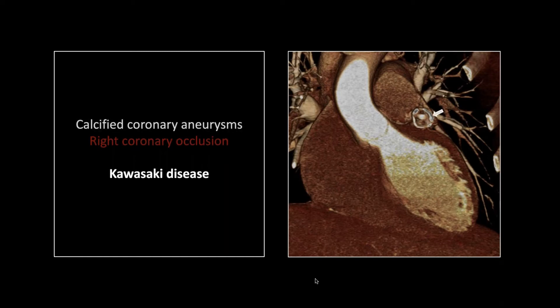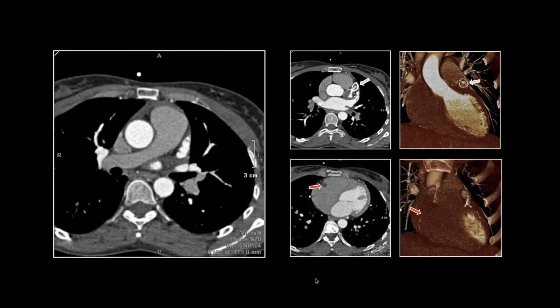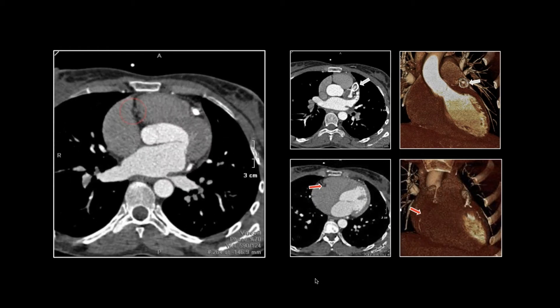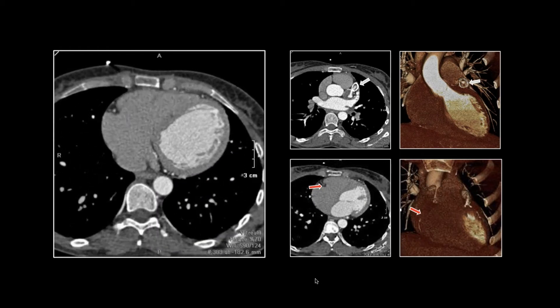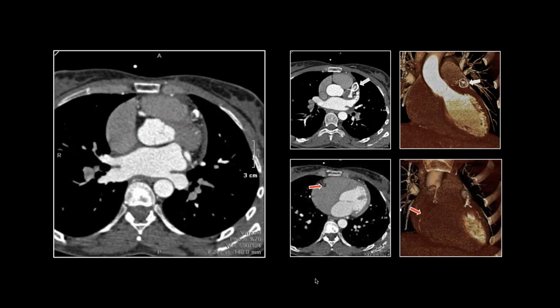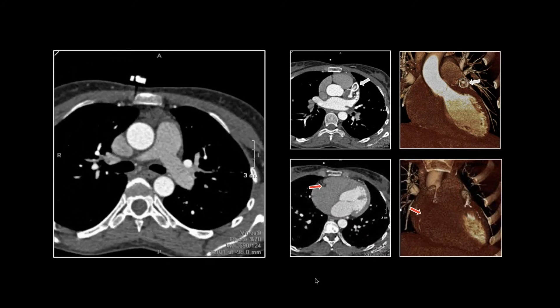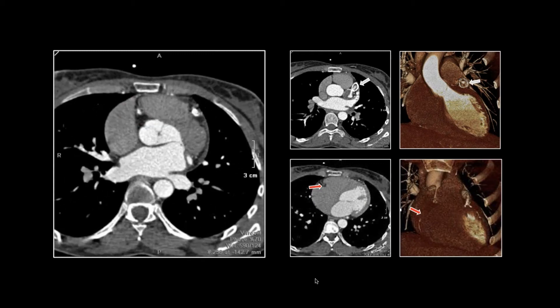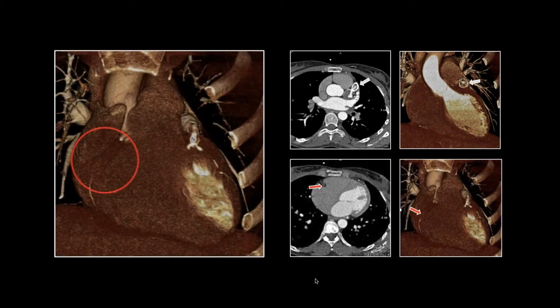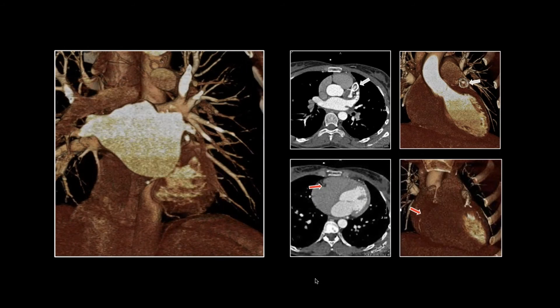The 3D is nice here — you can see the calcific rim of that aneurysm, and you can also see that occluded right coronary, which we ought to be seeing on the surface-shaded display. There they are: multiple calcified aneurysms, and there is the right coronary occlusion with some retrograde filling. Calcified aneurysms and a right coronary occlusion in a relatively young patient, further suggesting this was Kawasaki. There's that occluded segment of the right coronary, and there are the aneurysms — that's what they look like on a good 3D projection.